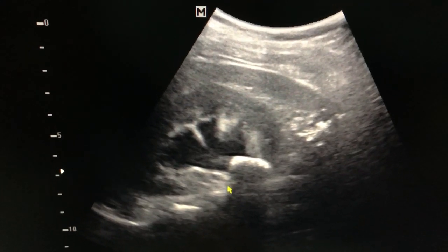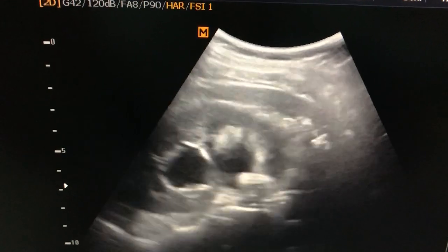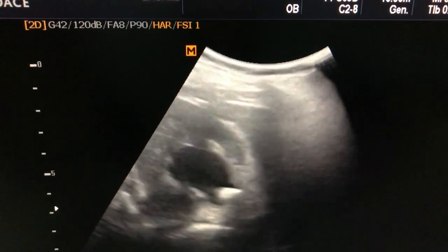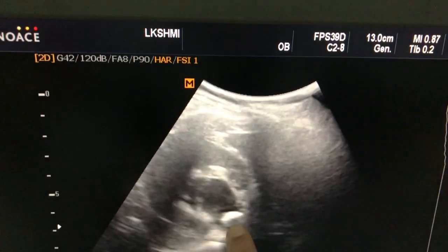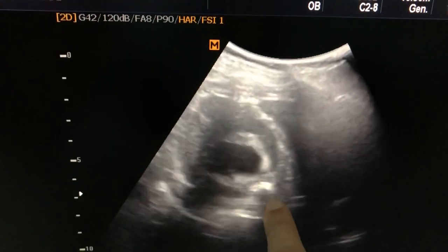This and this — this whole black area is the posterior acoustic shadow. In the transverse view of the kidney, we see that this calculus is in the pelvic ureteric junction, just at the periphery of the kidney.